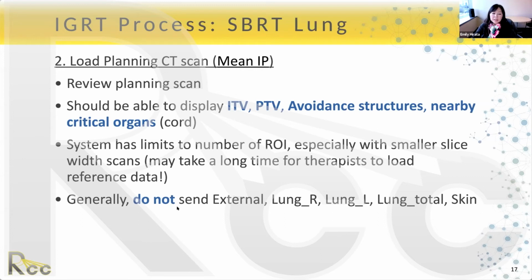So generally, you want to avoid sending the external contour of the body. You don't need to really send over the actual lung contour. You don't really need to send over the skin for IGRT purposes. So just some practical notes about that.